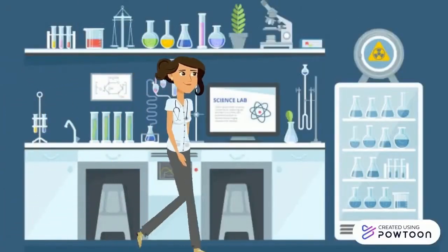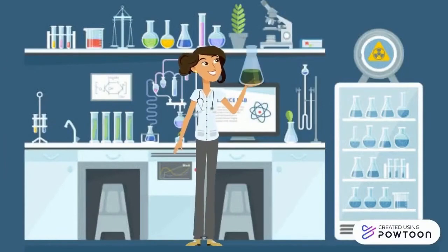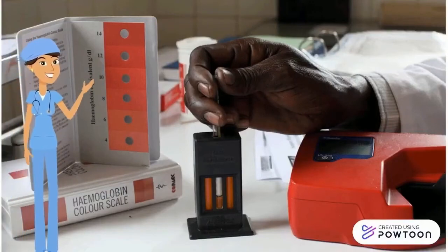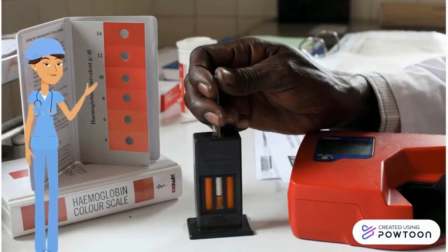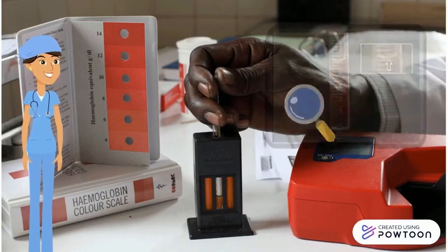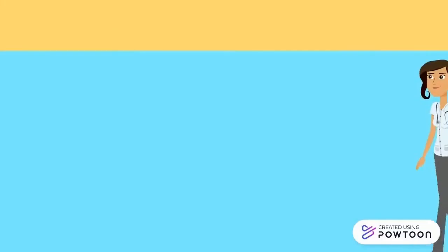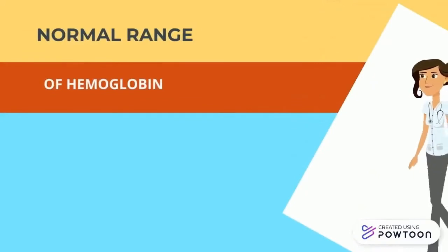Next, when distilled water was added, the color of the solution will be mixed. It should look the same as the comparator box color strip. Compare it at eye level and make sure the solution is brownish like the comparator box. Then, the lower meniscus needs to be read in hemoglobin gram percent in the Sahli's hemometer tube. The best result should be in a normal range of hemoglobin.